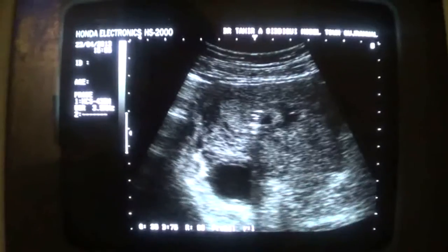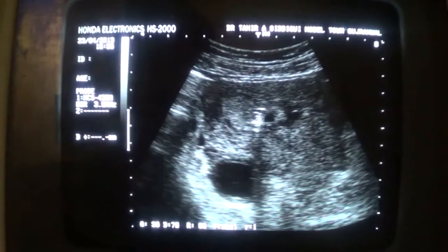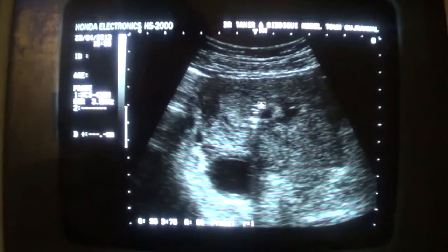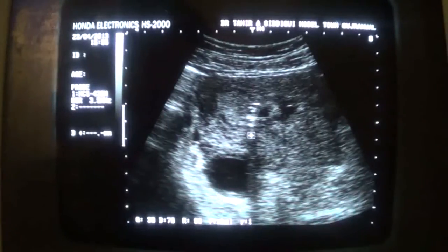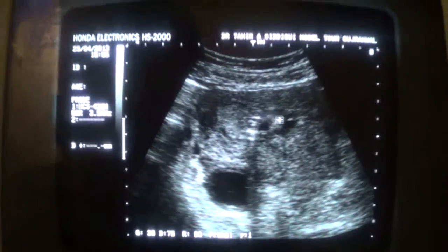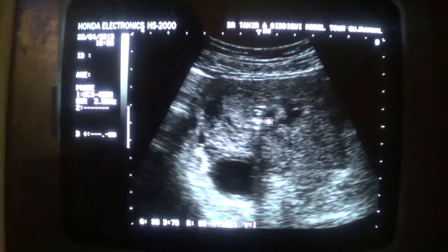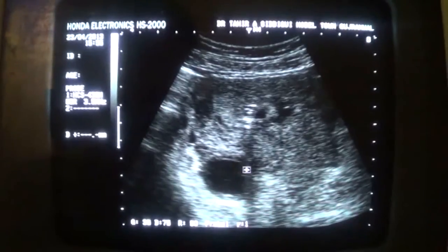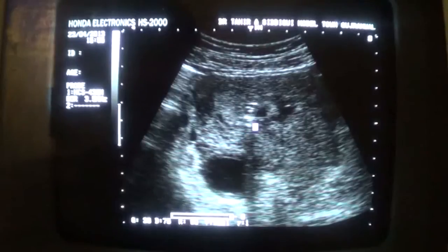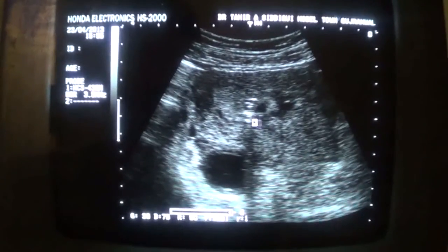Now I will show you the echogenic particles. These echogenic particles, tiny and giving posterior shadow as well, few of them are the RPOCs. They are more echogenic than the clot. Then this is a small amount of peri-sac fluid. This is the sac. This is the corpus luteum cyst. So this is a case of incomplete abortion, though induced.